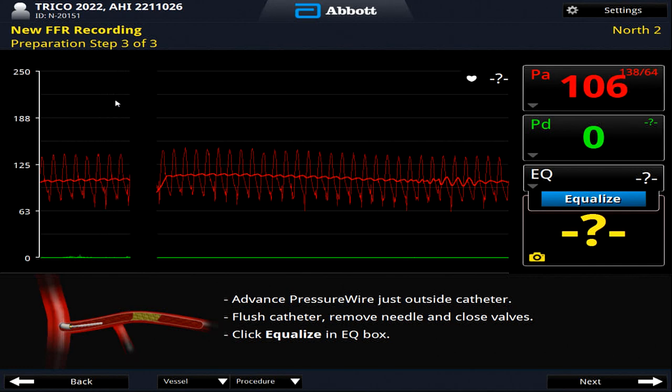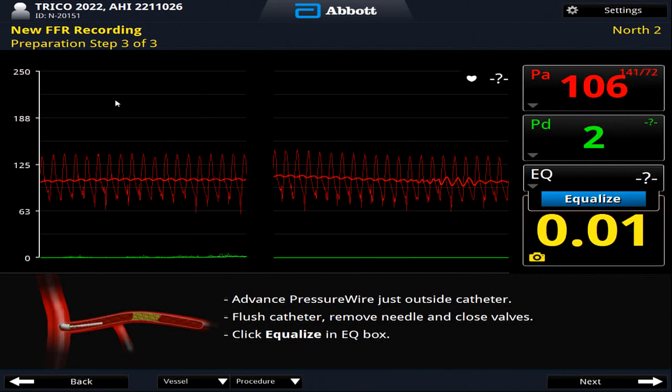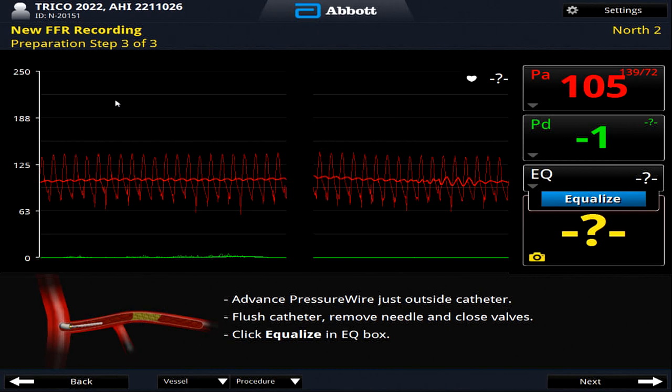I think I'm in total agreement, Professor. The point I'm making is I would introduce it. I don't think that calcium is stent expansion limiting, but I would not dilate this for the sake of dilating it unless I was prepared to stent it.